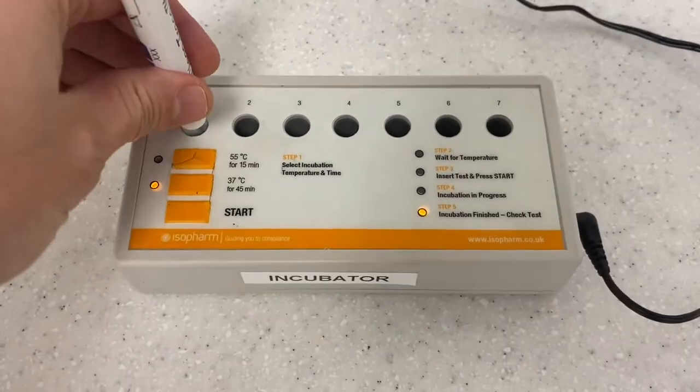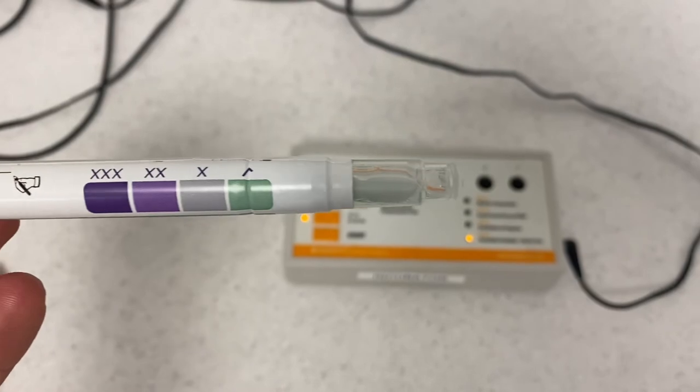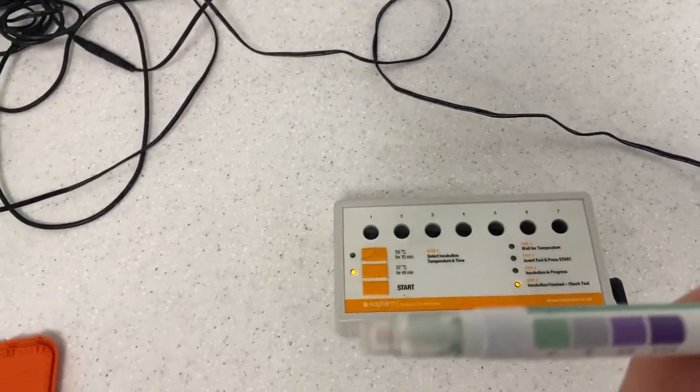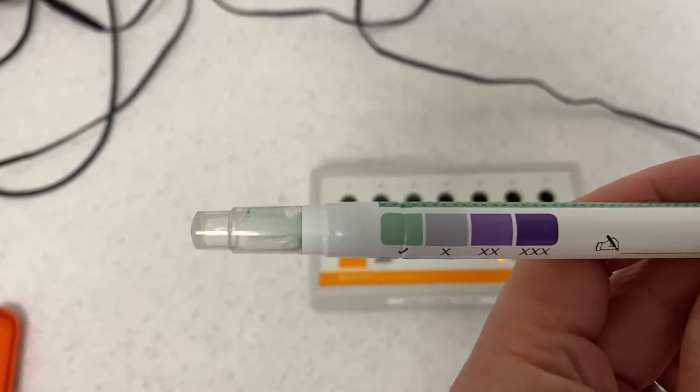Remove the Clean-Trace pen and check the color of the solution against the indicators. A green result is a pass, and any shade of purple is a fail.